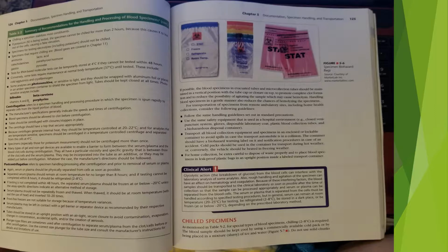Transport all blood collection equipment and specimens in an enclosed or lockable container to avoid spills in case of transport automobile is in a collision. The container should have a biohazard warning label on it and notification procedures in case of an accident.